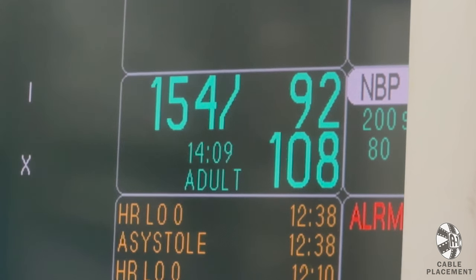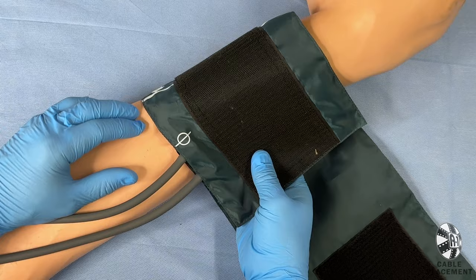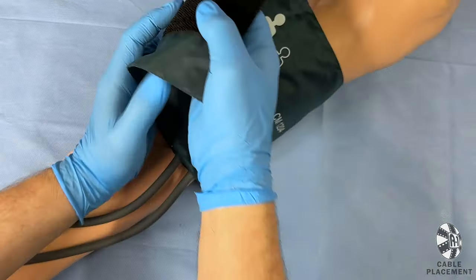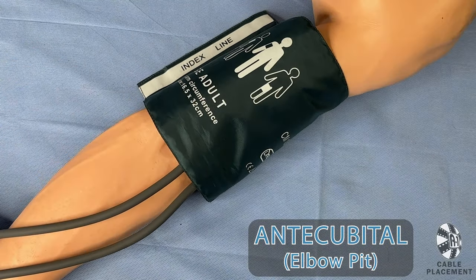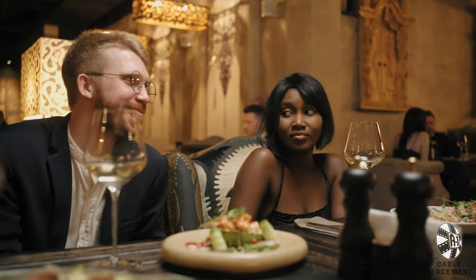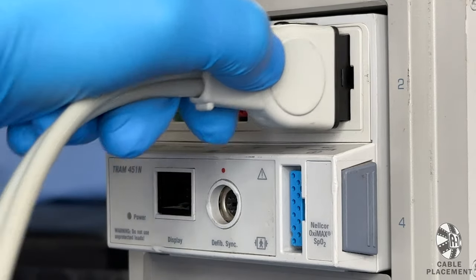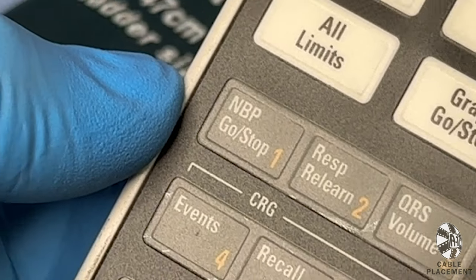For blood pressure, Velcro the BP cuff to your actor's bicep. The cuff will have a marking to show you where to line up the artery. This should be right above the elbow pit, or antecubital. Go ahead and use that term at your next dinner party and see how impressed everybody gets. Plug the black end of the cable into the black monitor input. Now push the button NBP Go Stop.